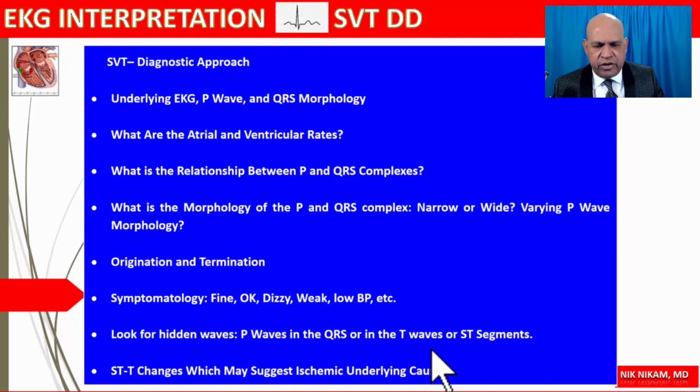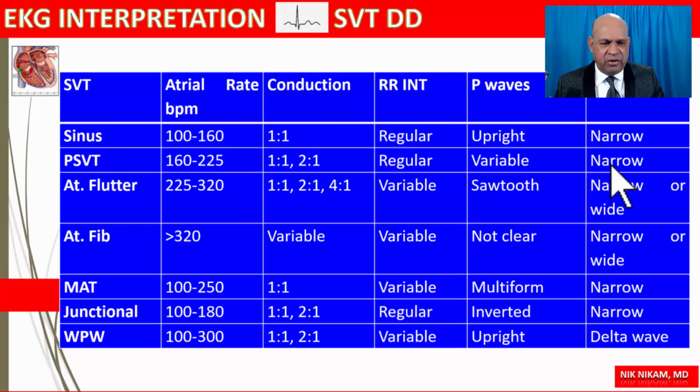And once the patient is stable, if you want, you can do electrophysiological studies to identify if you're dealing with atrial flutter, and how to do ablation and get rid of almost 98% of the atrial flutter. Okay, let's continue. Here is a chart. It looks very complicated, but it's very simple.